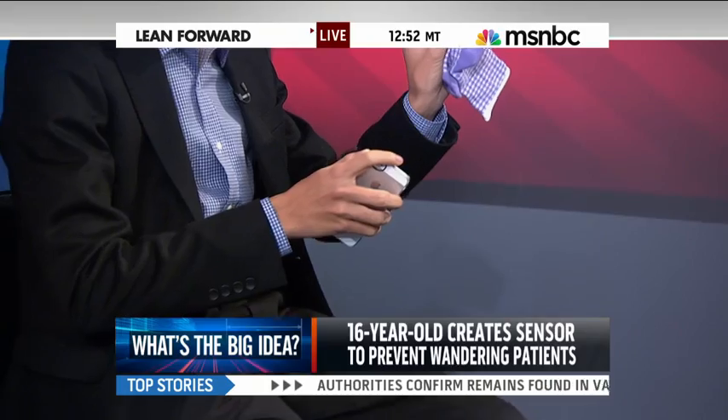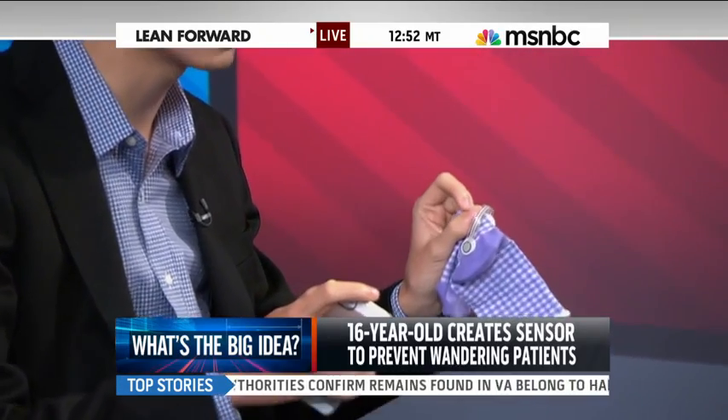Kenneth, how does this thing work? You've got the sock in your hand and a smartphone there. So it's a device that consists of a pressure sensor and a circuit. The pressure sensor is adhered to the bottom of the patient's sock, or to the bottom of the patient's foot.